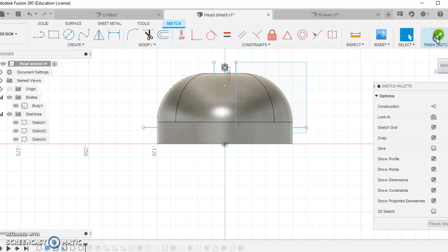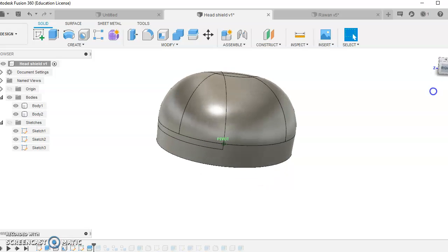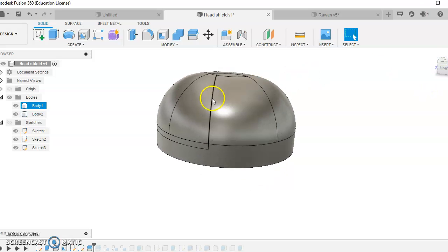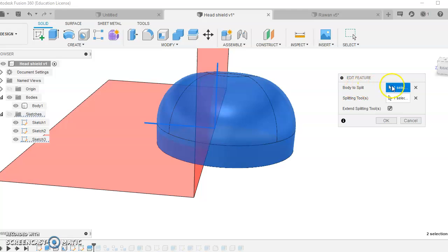Okay, so once you've done that, you would then just finish the sketch because I've edited it, so I finished the sketch. I move on to the next part, which would then be a really good function where you split that body into components. So what we do here, we select the body to split. Now with the splitting tool, you have to select the lines that you're going to split. That's going to cut it through at 90 degrees. So over here on the left hand side window, you've got sketches. Now just be aware, sometimes when you go into this function, the sketches automatically turn off. So make sure you switch them on like I'm doing now. I'll turn that sketch off just to show you what I mean. Now you watch that, it'll disappear. Okay? Good.